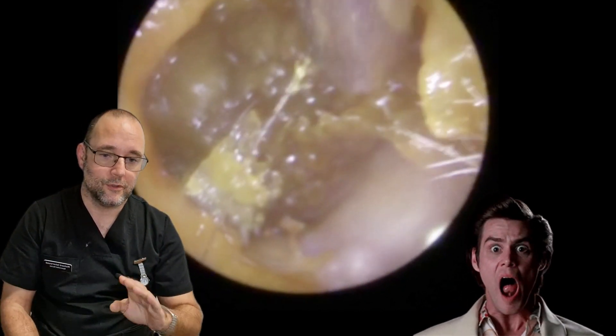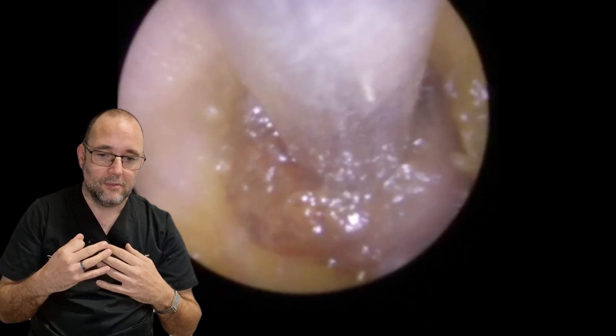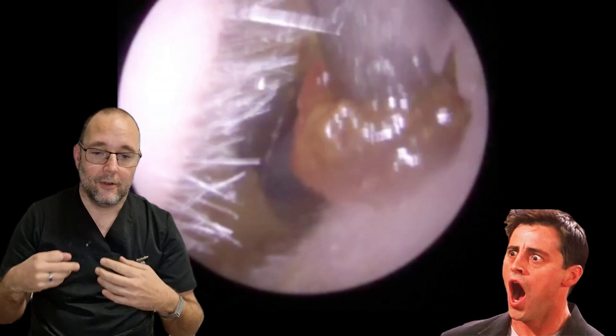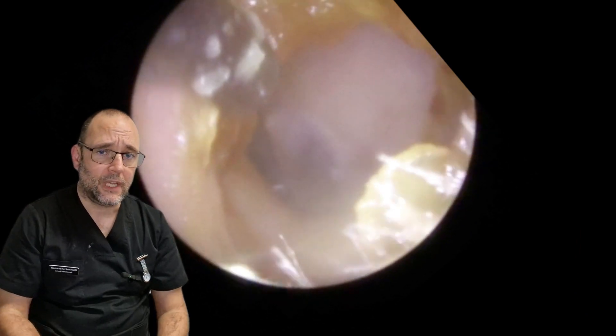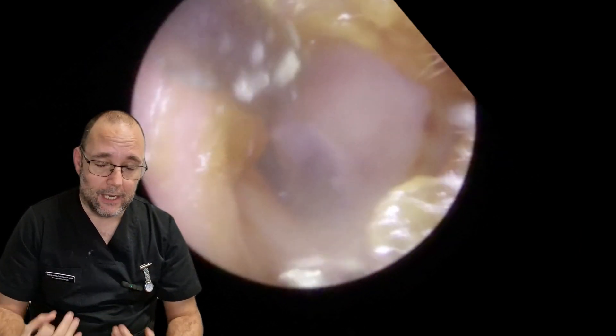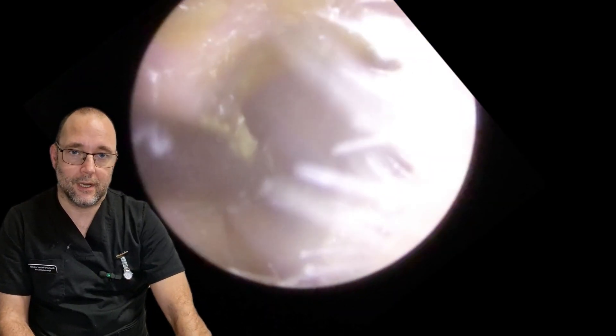There you go, the whole thing jumped up. We just got to grab that edge there — look at this, all coming out, a lovely mushy little blob. It was a big blob when it was in there. Most of it disappears up the tube, so really no real shots at the end because it all shot up the tube and into the tank.